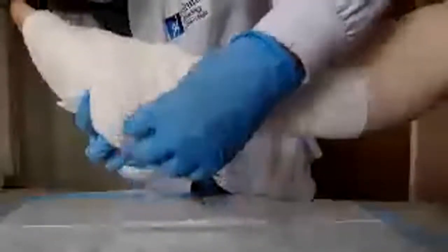So bring it back around. Once again, keep the fold right here, cover it, but make certain that that's an area so that when Karen flexes her heel, you can see it opens up, but once she straightens her foot again, it should cover back up again. And that is showing me that it's not. So you want to make certain the ace wrap will. Yes, the ace wrap will, most definitely. You want to make certain that that is covered and protected.